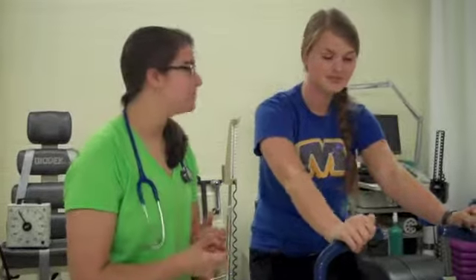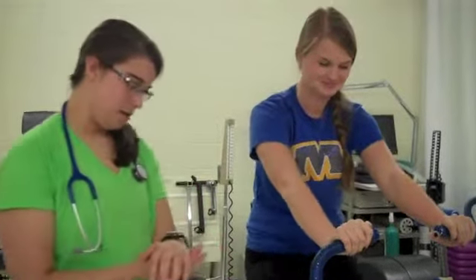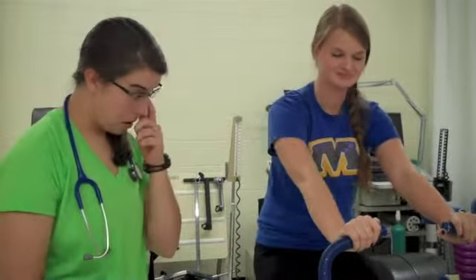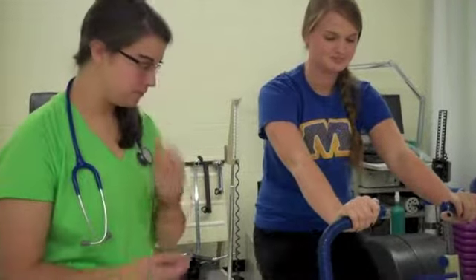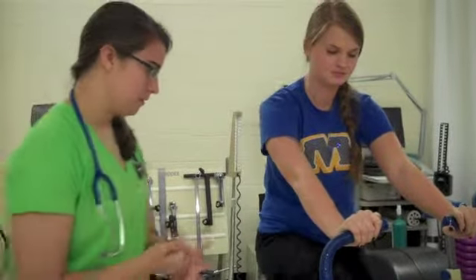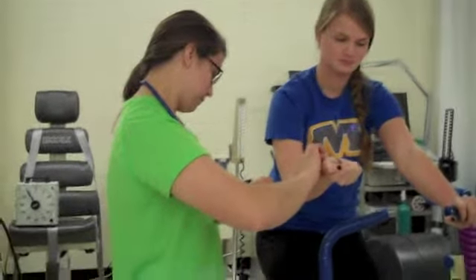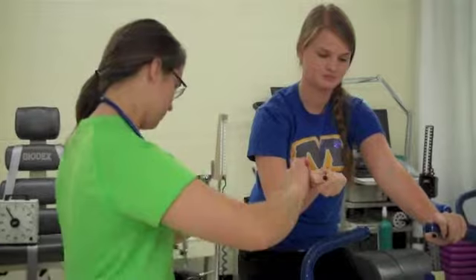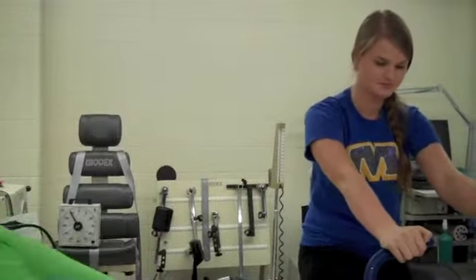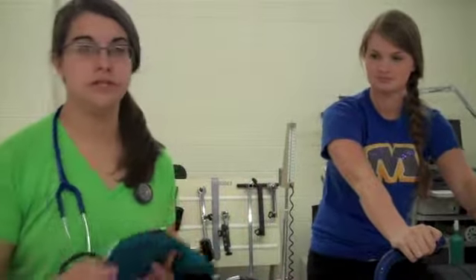How are you feeling, Ashley? I feel good. Okay. We're going to take another heart rate in 15 more seconds. Ashley's heart rate is now at 95. So now I'm going to take a blood pressure, and then we'll determine what workload she needs for her next stage.